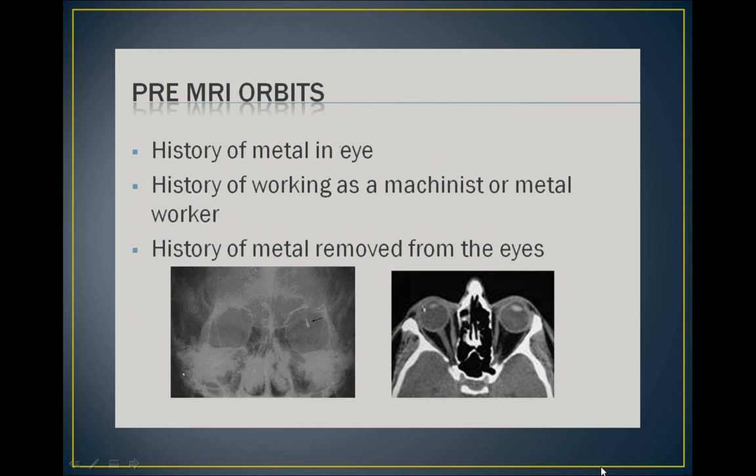Patients sometimes will try to talk their way out of having an X-ray, because in most cases it will delay their MRI exam, and the patient may or may not be able to get scanned right away, or may even have to reschedule their appointment. If this happens, you should explain to the patient that their vision is in jeopardy and it is our protocol to have an X-ray first, and as a technologist, our license will be at risk if something were to happen to them.